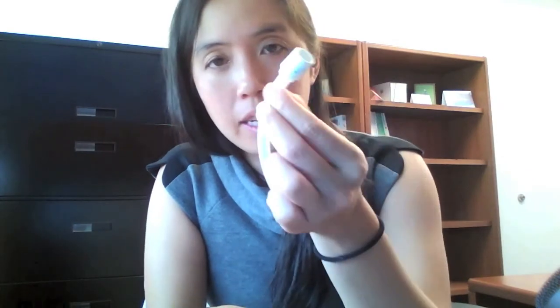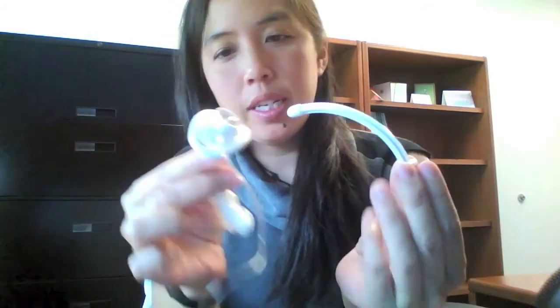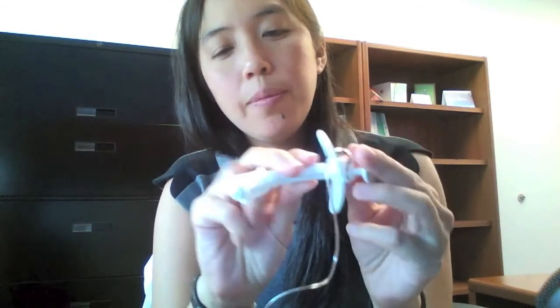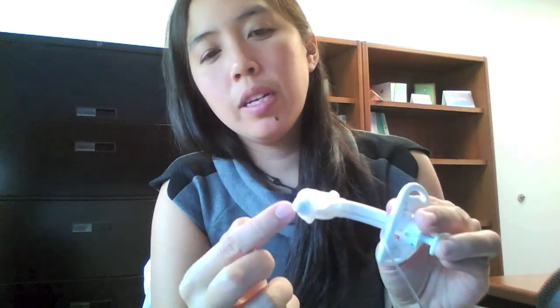Again, this is called the outer cannula. This is an inner cannula. And this is known as an obturator. The obturator is primarily used when placing a trach. You can see it goes into the outer cannula and it helps smooth out this tip region to make it easier to place the trach.